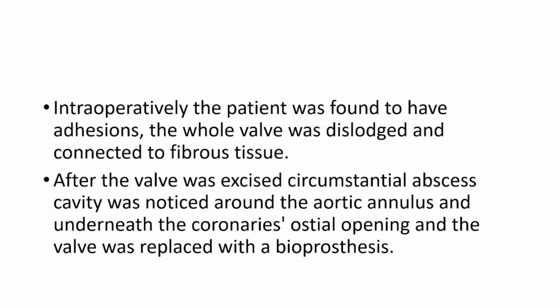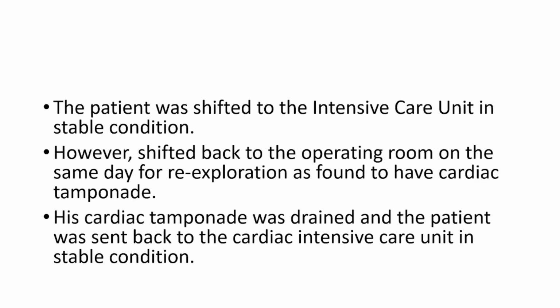This is intraoperative. They told me that the valve was about to dislodge. It was only attached to the body with a few fibers. And then he used a new technique. He told me about this technique, excising the abscess, and he did the coronaries and everything. The patient was already shifted to the intensive care unit, but in the night he developed tamponade. They took him again to surgery, and then he recovered.